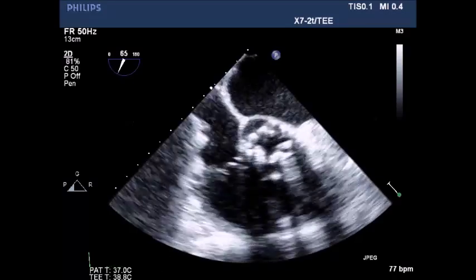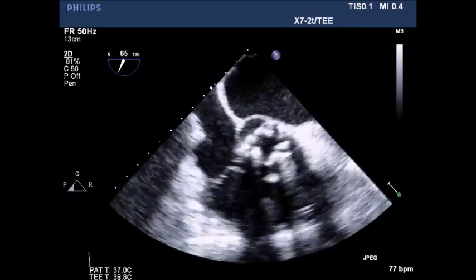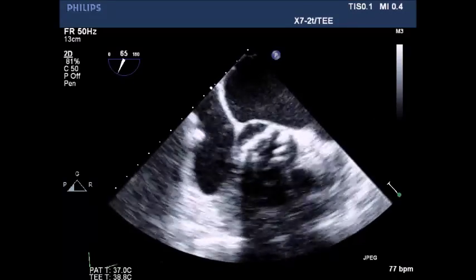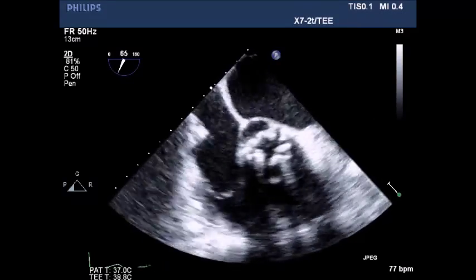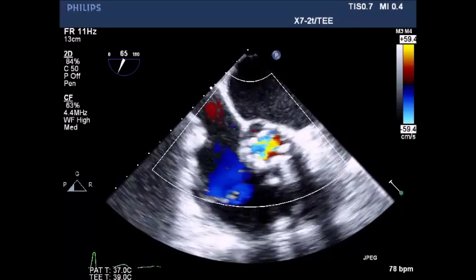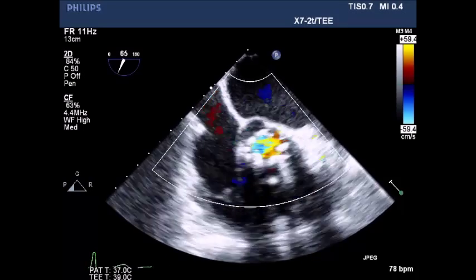Aortic valve views and analysis — short axis view of the aortic valve showing a highly calcified valve, possibly bicuspid. Normal tricuspid valve with a normal color flow pattern is also noted.